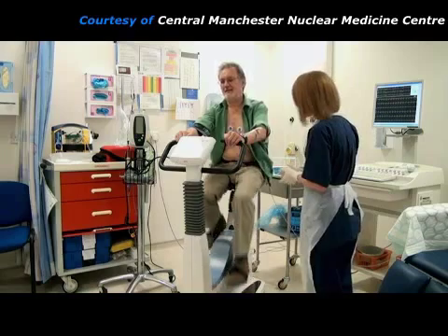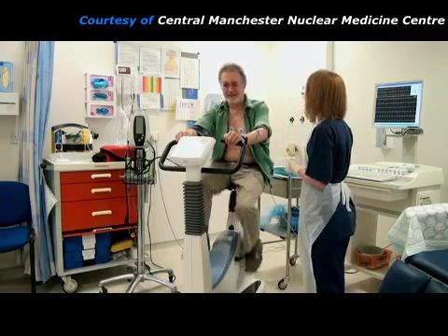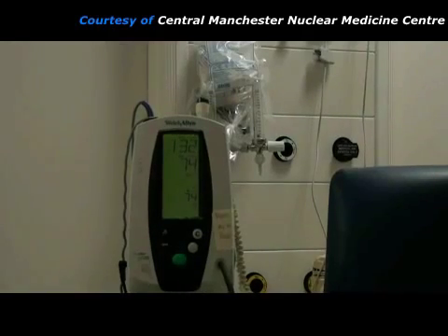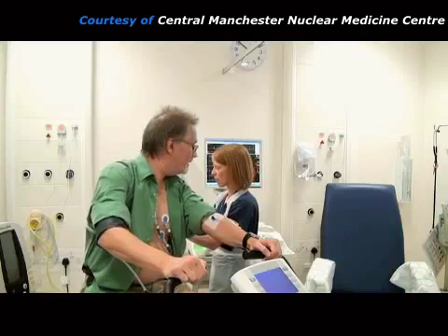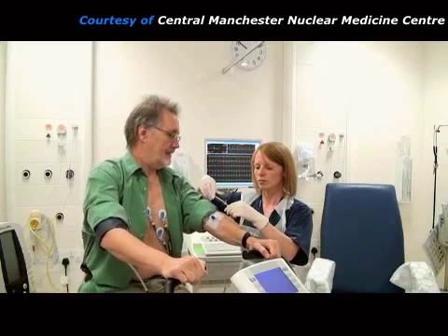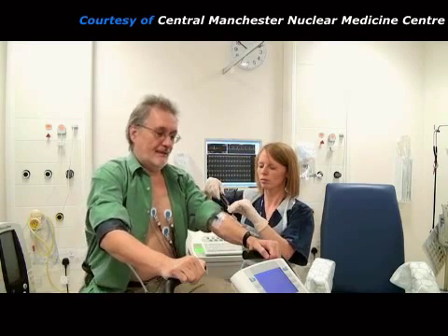The practitioner checks whether the patient is experiencing any symptoms and encourages them to keep going. She monitors the patient's heart using the ECG machine and keeps an eye on their blood pressure. When the patient has exercised to near their limit, the practitioner injects a radioactive chemical, called a radiopharmaceutical, through the needle that was previously placed in their arm.